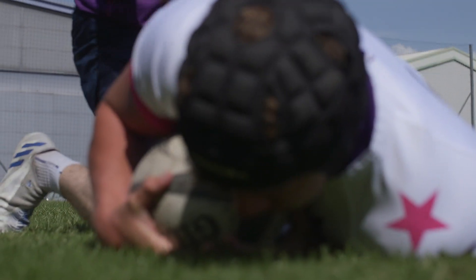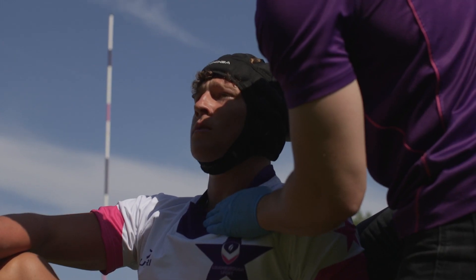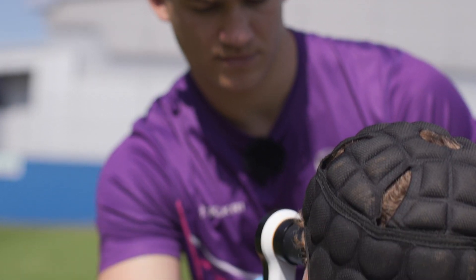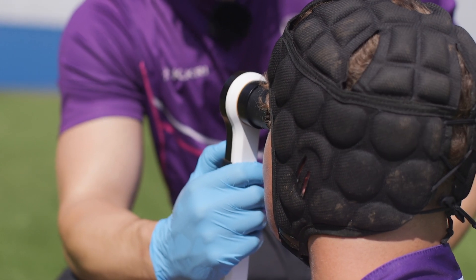We want to use this device to allow players to detect concussions, understand the severity of their concussion, and be able to take the time off that they need to fully rest and recover so that they can return to play and prolong their careers.